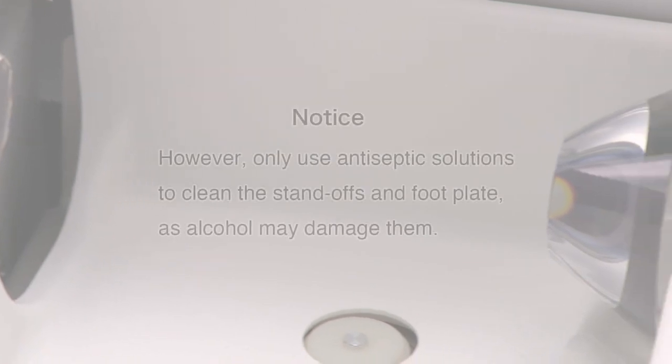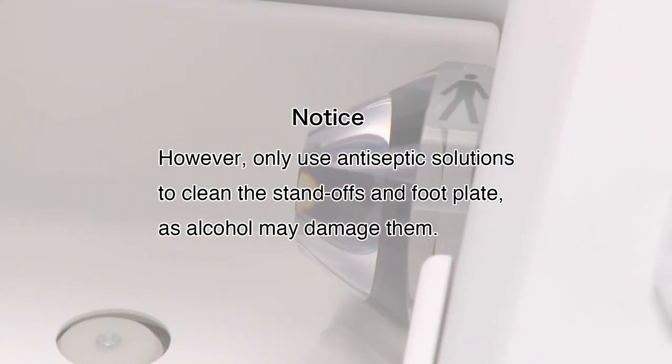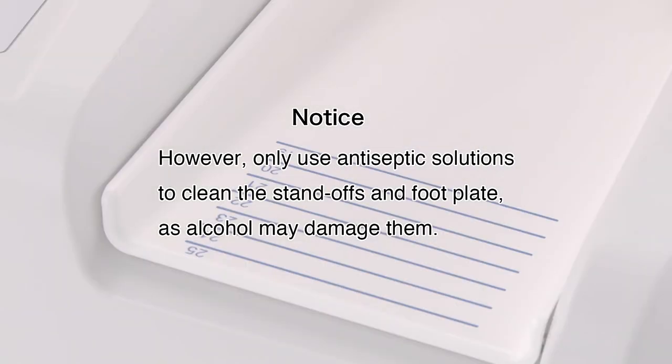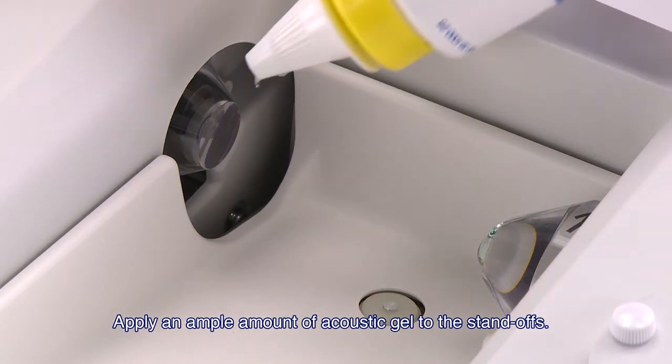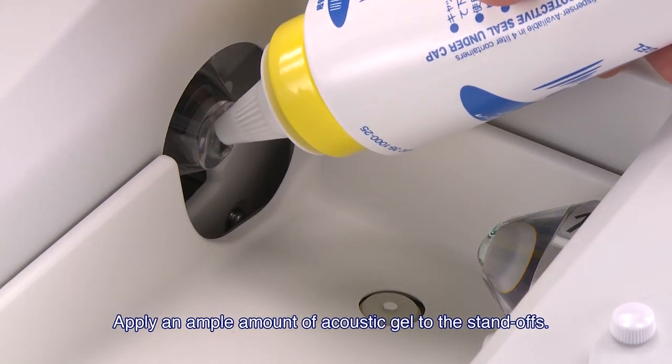However, only use antiseptic solutions to clean the standoffs and footplate, as alcohol may damage them. Apply an ample amount of acoustic gel to the standoffs, taking care not to drop the gel onto the unit.